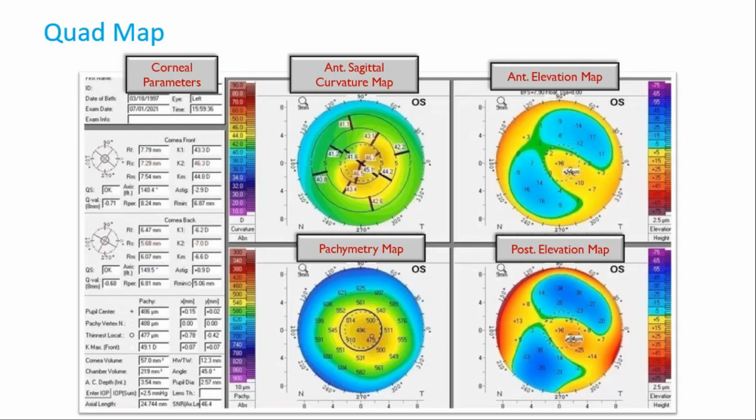Even if you can look up how much the Vario can capture, the topographer which we use in the LASIK center, and update us on the doctors group tomorrow about the range of keratometry possible with topographers, and maybe even with Orbscan, what is the limit of the keratometries that can be captured? That will be useful to us to know how to go about it.